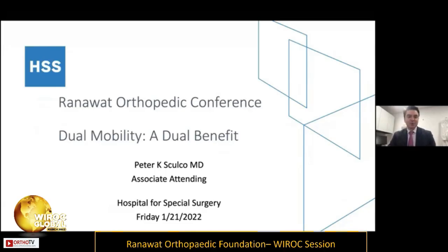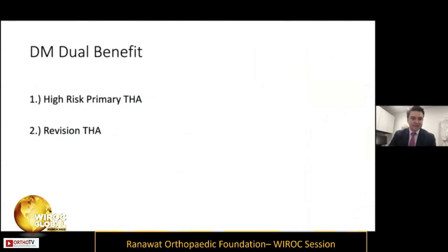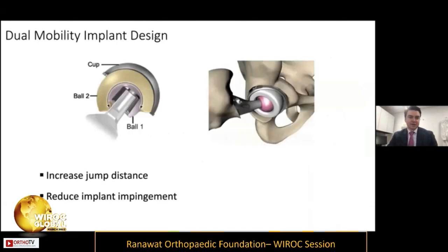I'm going to present basically dual mobility. I'm going to say it has a dual benefit. And basically, I'm going to emphasize that dual benefit, like John emphasized, in that high-risk primary total hip replacement patient, and also definitely in the revision total hip patient. So we reviewed this nicely already, dual mobility implant design, monoblock or modular.